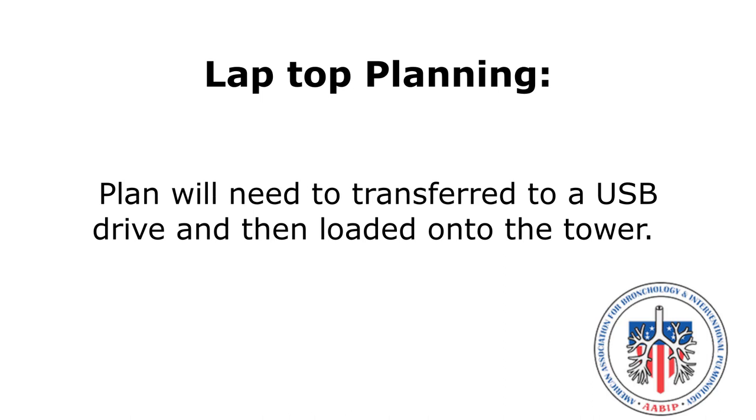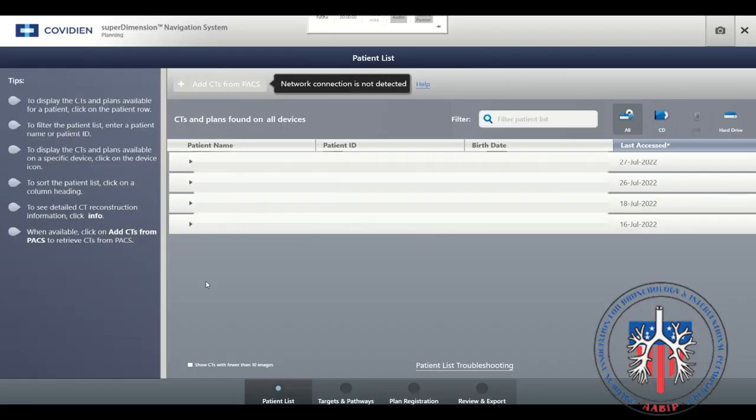The plan will need to be transferred to a USB drive and then loaded onto the tower. When the plan is loaded, the patient's name will appear here.